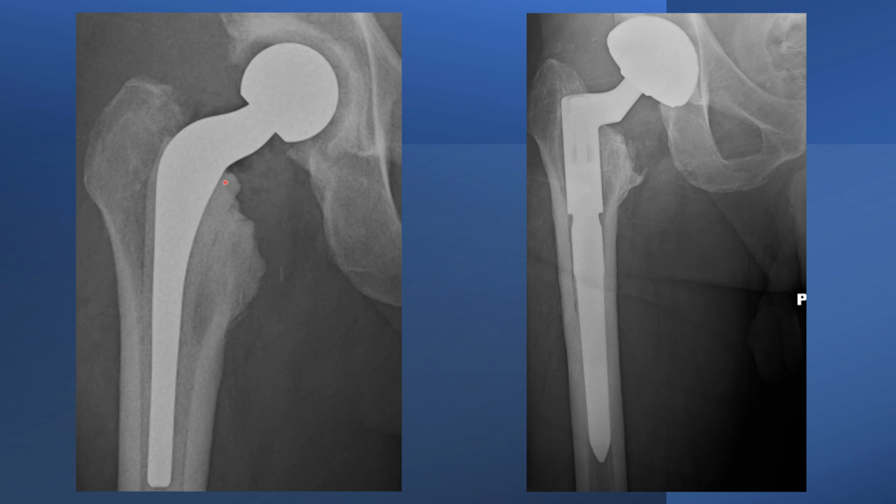This is what the reimplantation looks like. So here we are after stage 1. We put in an antibiotic temporary spacer. You can see a hip replacement. It's got a cemented surrounding. This is all full of antibiotics that are specific to that bacteria. There's a polyethylene component and cement around that. We've gone back and then we've put in a permanent implant. We typically use a fluted taper modular stem with a dual mobility bearing system.